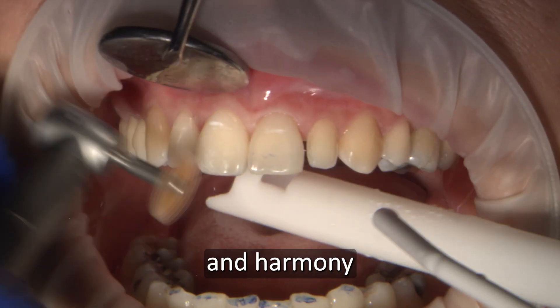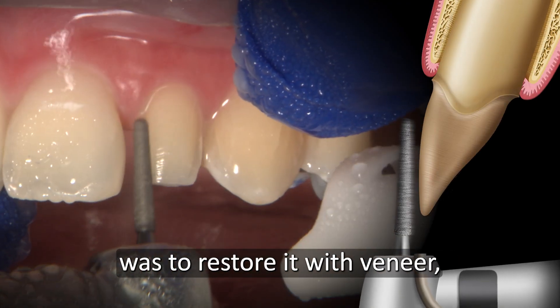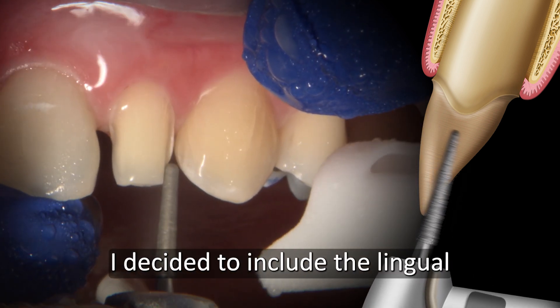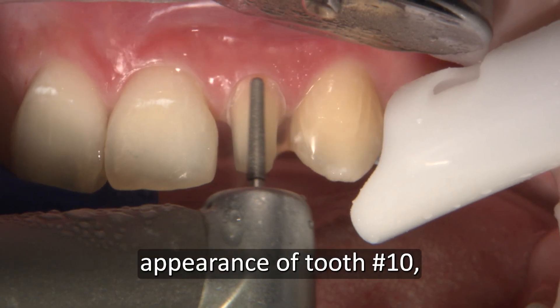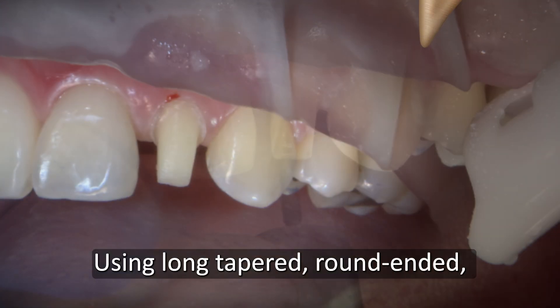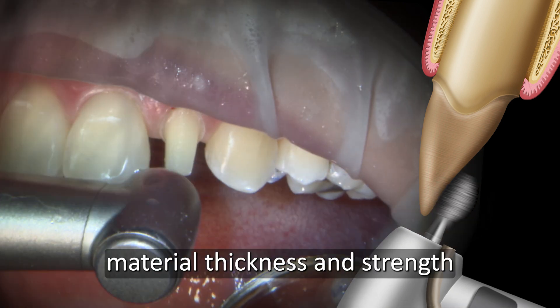Now that symmetry and harmony are accomplished through selective enamelplasty and bonded restorations, my attention goes to the peg lateral number 10. My initial approach was to restore it with a veneer, but the large gingival embrasure space between numbers 9 and 10 required me to place my margin more lingually to gain more aesthetics. I decided to include the lingual and plan for a full coverage restoration. To fix the baby tooth appearance of number 10, I decided that Obsidian All Ceramic would be the most suitable material, satisfying the patient's need for a full coverage crown with lifelike aesthetics. Using long tapered round-ended and football diamond burrs, I prepared the tooth equigingivally with a 0.5 chamfer margin to provide enough material thickness and strength.